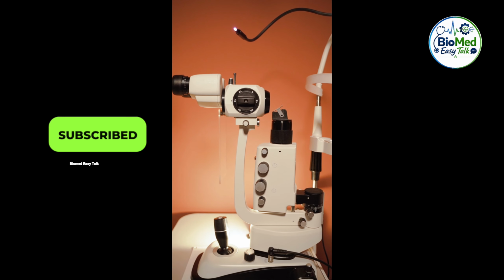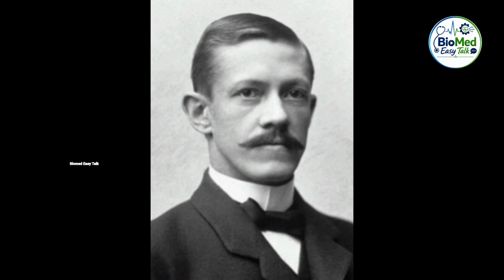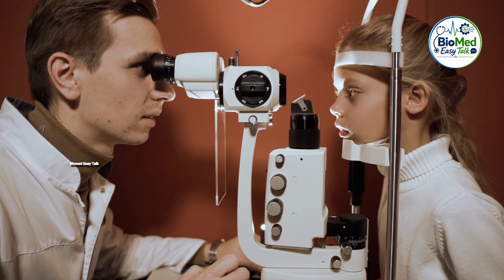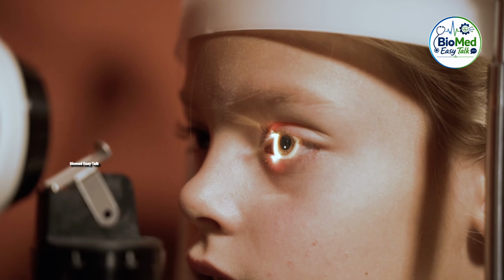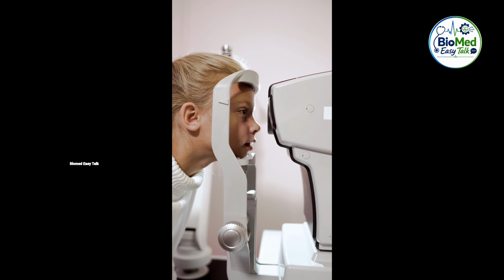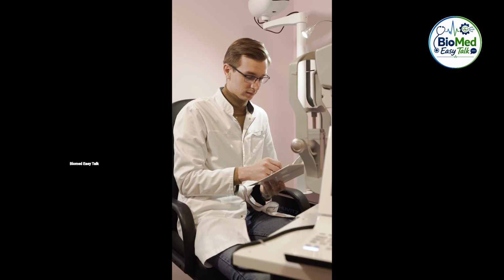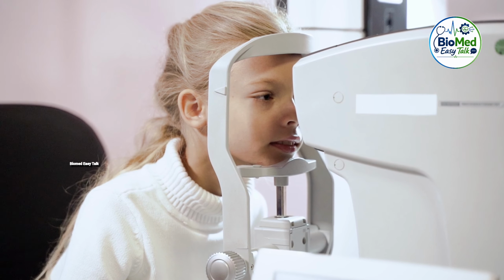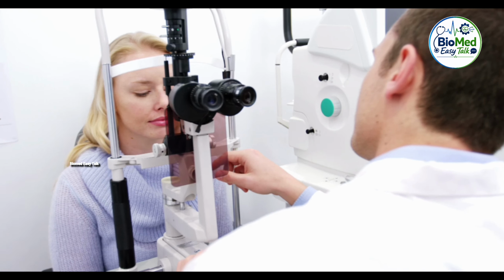Slit lamp microscope was invented by Alvar Gullstrand. For example, slit lamp microscope is like a flashlight plus magnifying glass for the eye, helping doctors see tiny eye problems clearly. Principle of slit lamp microscope combines a bright slit light and a binocular microscope to give a magnified 3D view of the eye.